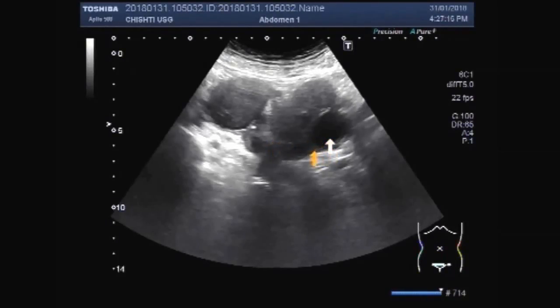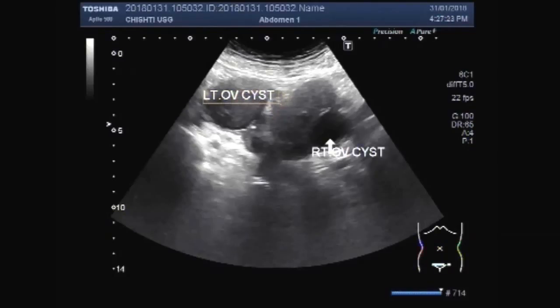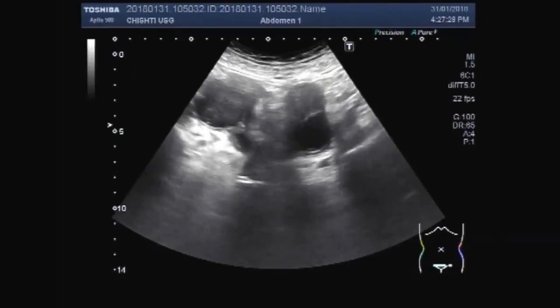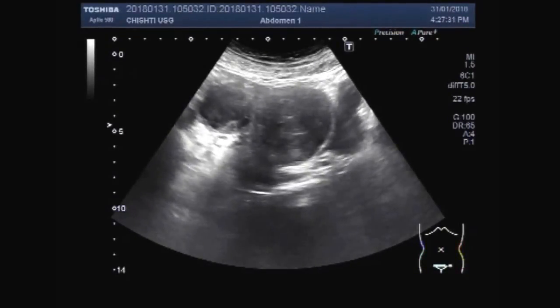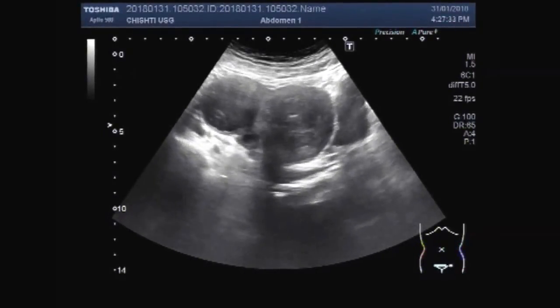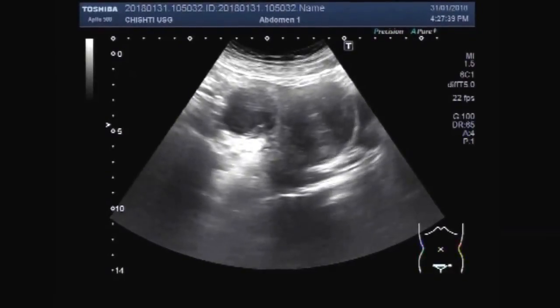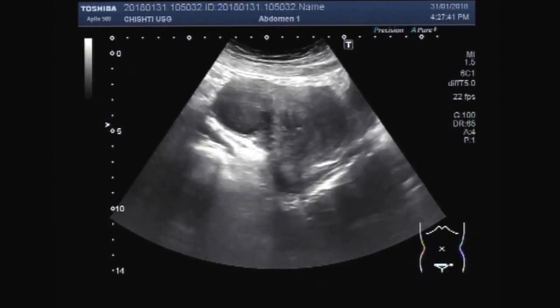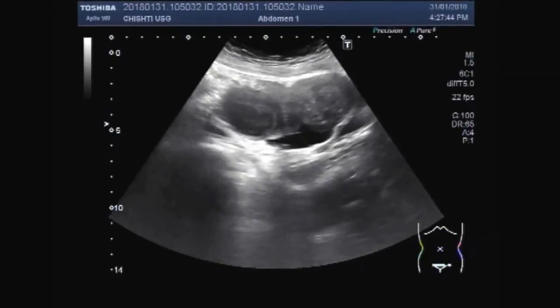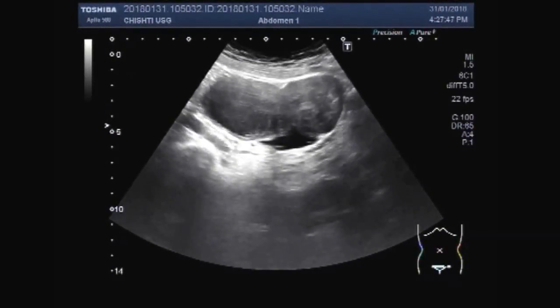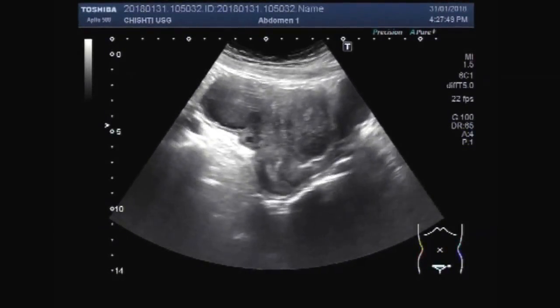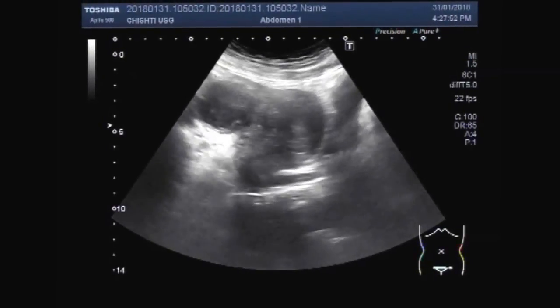This one is the right ovarian simple cyst. The mass on the right-hand side of the screen is a uterine mass.